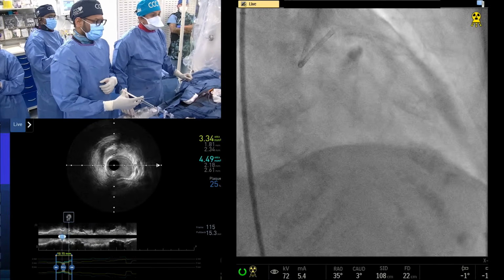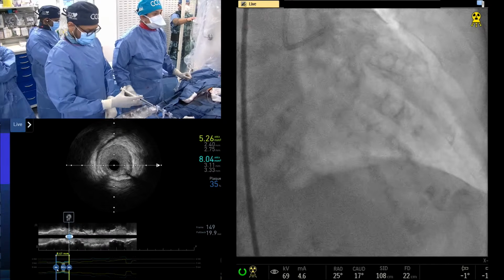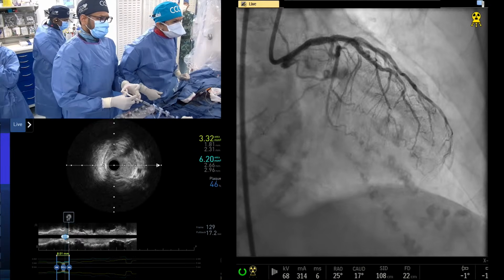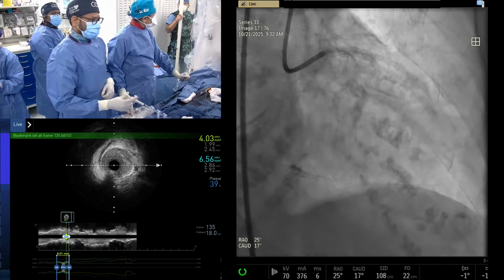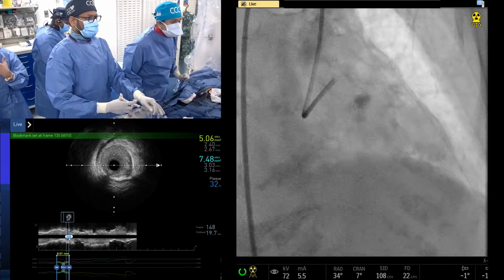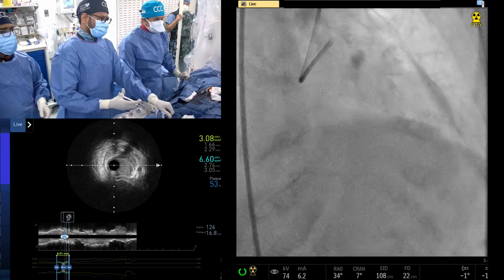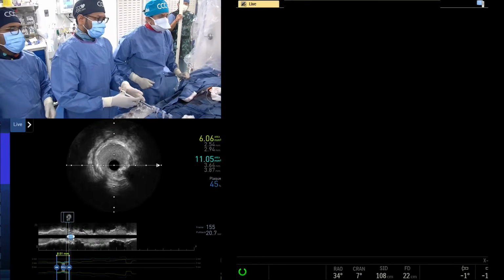How much is the length of it? Yeah, that's a good point. I mean, some people will use that 5 millimeter cutoff also, no? 2 millimeter actually. Yeah. I would do, in this kind of case, I'm the only user, 2 bolus of integralin and be happy. Okay, 2 millimeter, 90 degree, 2 millimeter. Yeah. So exactly sitting on the fence.